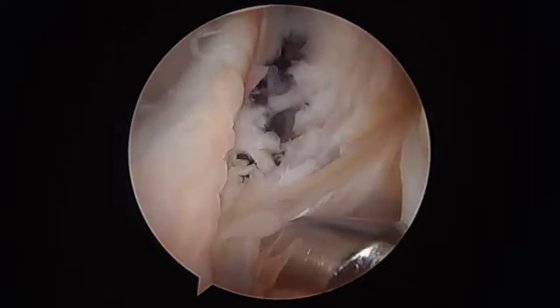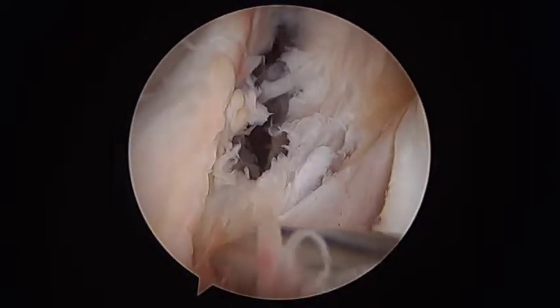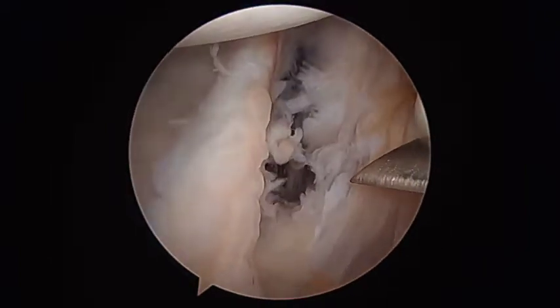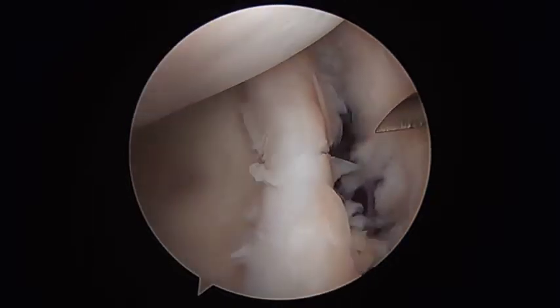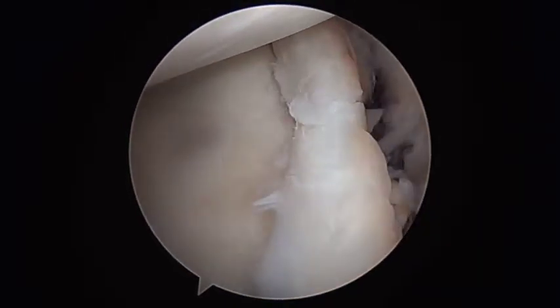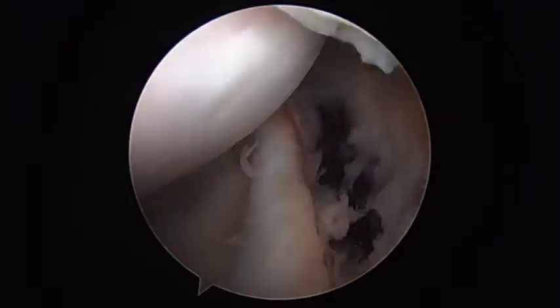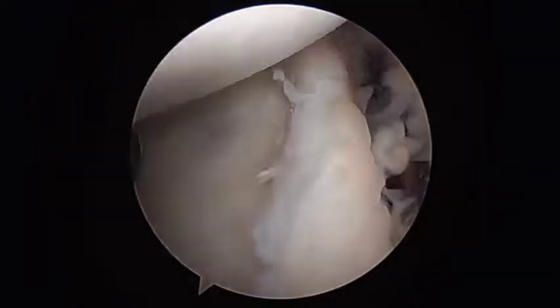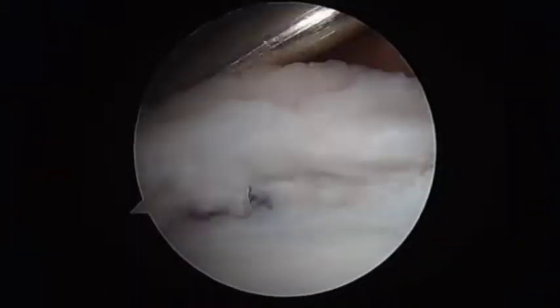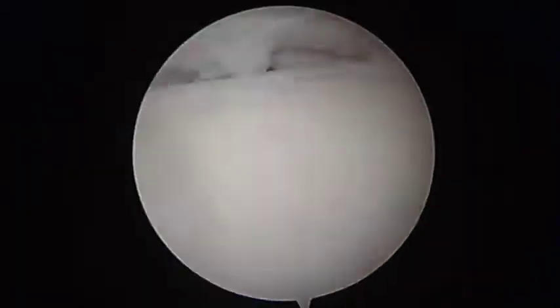Additionally, the anterior-inferior and posterior-inferior capsular structures were well attached down to the humerus. Importantly, we note from this that there's both a Bankart tear as well as a capsular split. Therefore, the capsule is torn and needs to be addressed in addition to the labrum. This unique pattern was a variant in which the labrum was torn off the bone, but also the capsule more anteriorly, demonstrating a floating labrum.